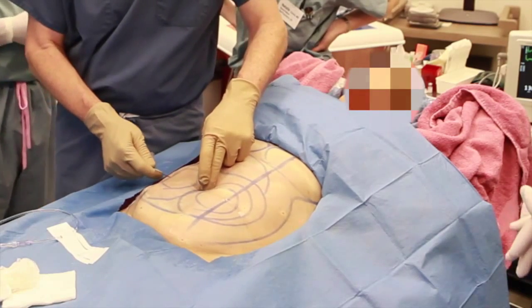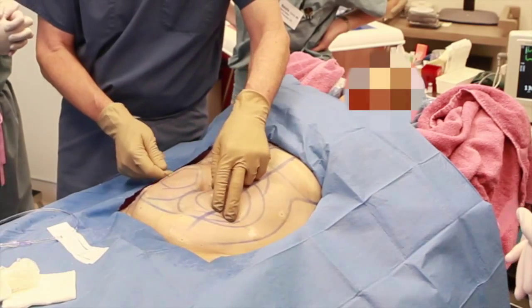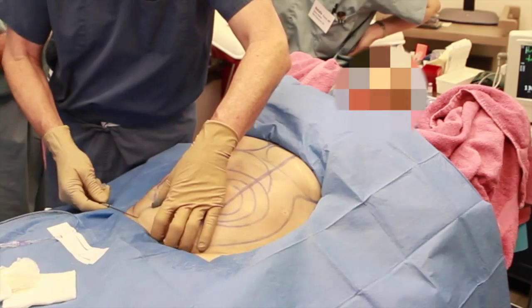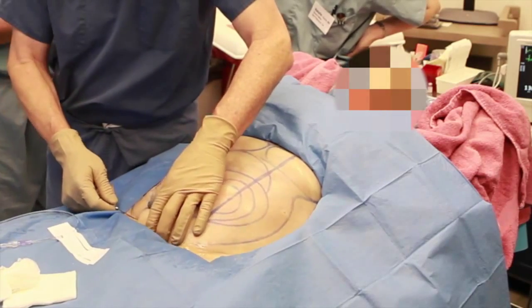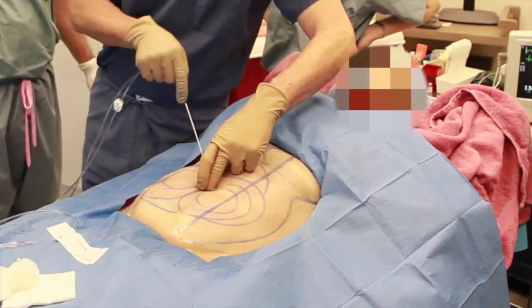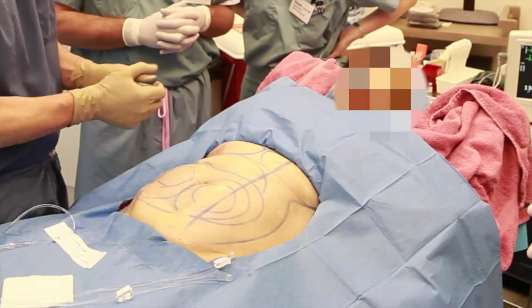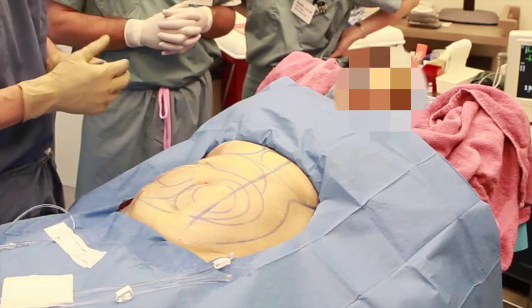Now we're switching to a single tip Monty to infiltrate around the umbilicus. This is the final stage of the tumescent anesthesia, infiltrating wherever there is less than full tumescence. We're also simultaneously checking for good anesthesia — the patients tell us that there is no discomfort, or if there is any discomfort we'll infiltrate more anesthesia in that location.